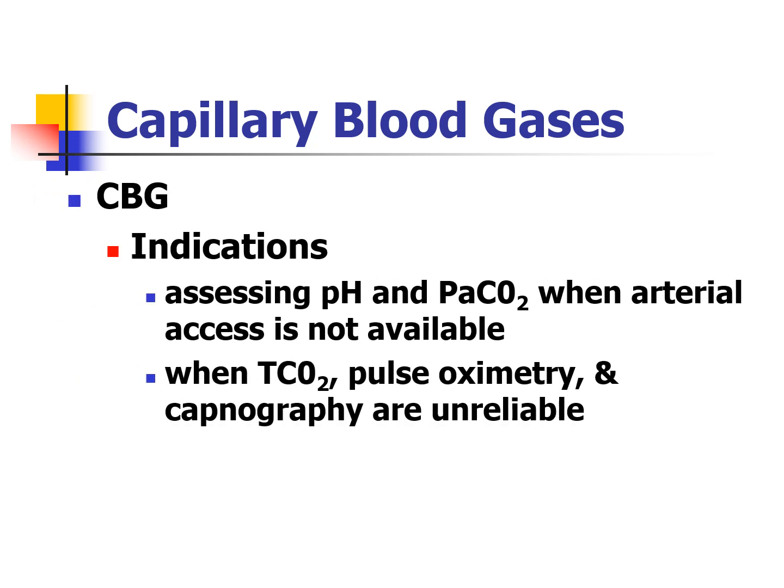Capillary blood gases. These are more done in neonates, the NICU world. We love these up there. We don't have to poke the arteries. We're going to just look at pH and CO2. So it's ventilation. With babies, the pulse oximetry is very accurate, so we don't really have to worry about blood gases for oxygenation. We're more looking at ventilation with blood gas, and that's where cap gas comes in. So we're going to look at the pH and CO2.